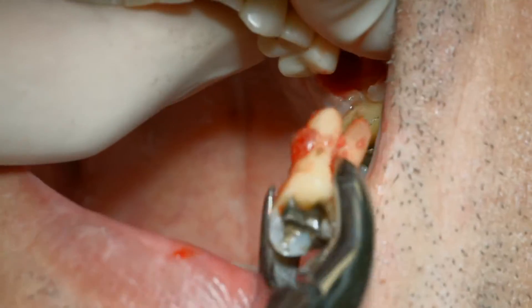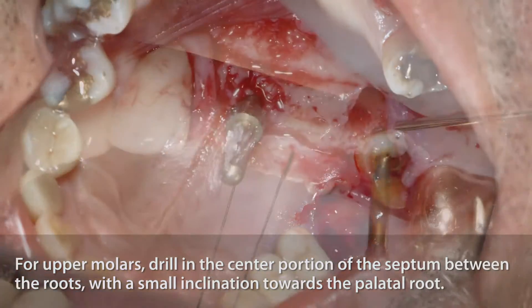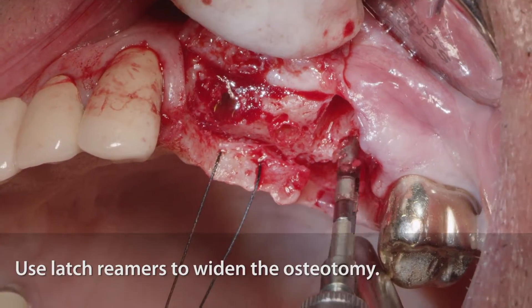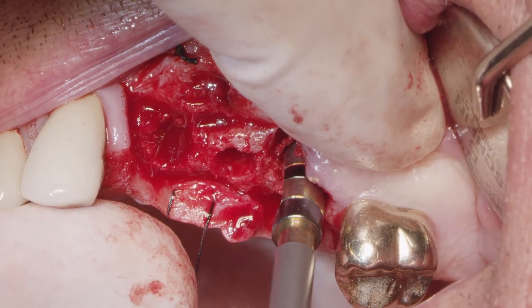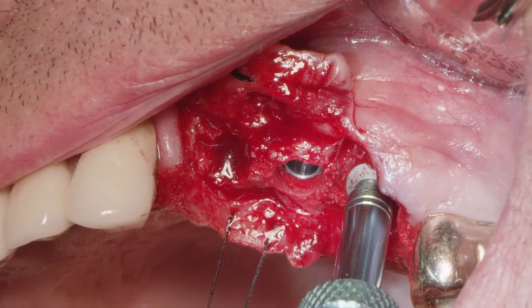For the upper implants, the procedure is very similar. However, we must take into consideration the anatomy. Keep in mind, the upper molars have three roots. So the surgical technique starts as well with the pilot drill, aiming at the center of the socket or the center of the septum area in between the roots, with a slight inclination towards the palatal root. Once you reach the proper depth and direction using the anatomy, we start using the rimmers — either the latch rimmers or the hand rimmers as you prefer. The septum bone shall also collapse and form a wall to stabilize the implant, in conjunction with the palatal root socket walls, stabilizing the implant in the ideal position.